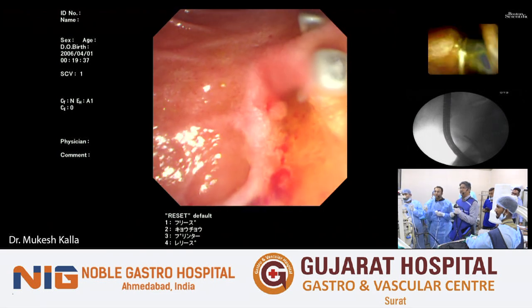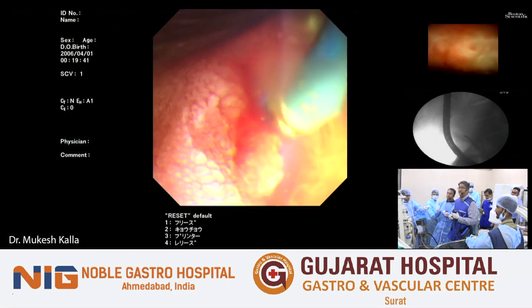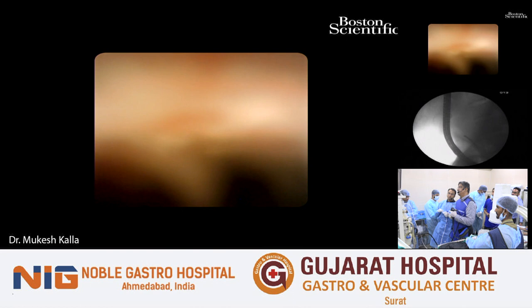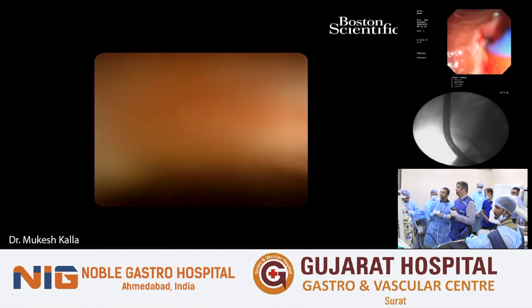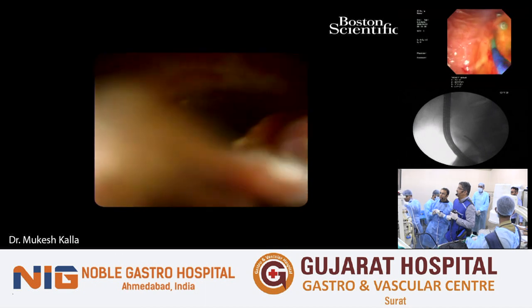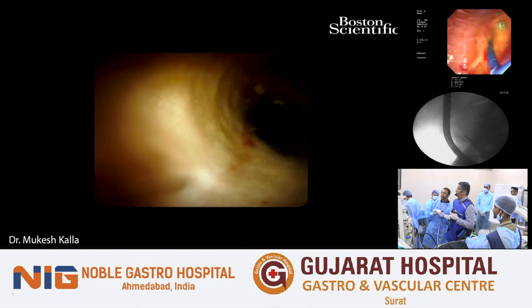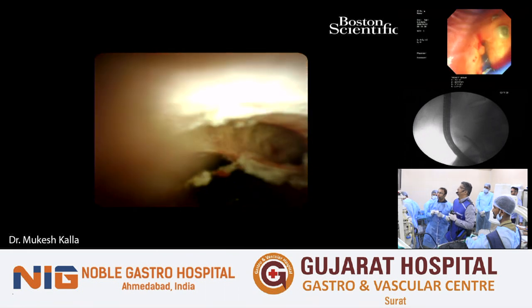So we've seen till the hilum, it was okay. If you want, we can go back to the cystic duct and see the end of it and ensure that there are no further stones inside. It's a wonderful equipment actually. It gives us great liberty and with this DS2, the image is so good. Yes, sir.